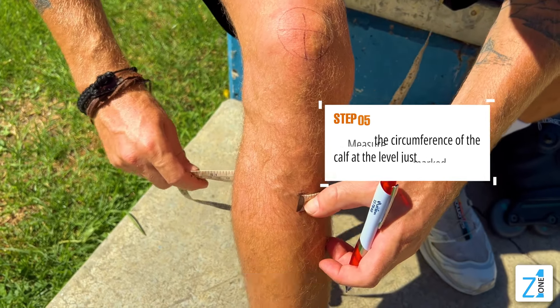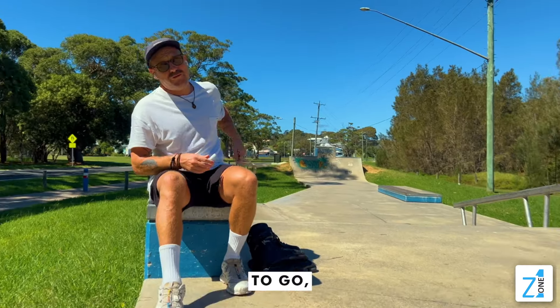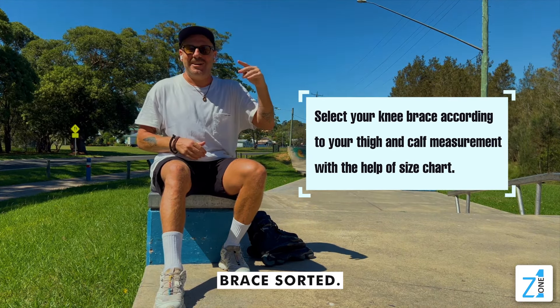Wrap it around and then mark your measurements in your book. Once you have that, you're good to go — send it through to the guys at Z1 and get your custom made brace sorted. Let's go!